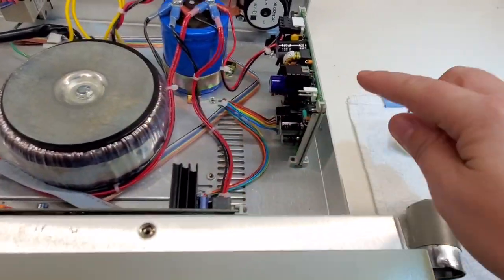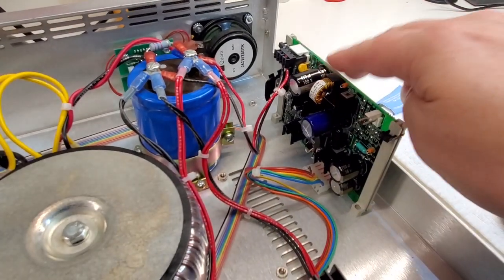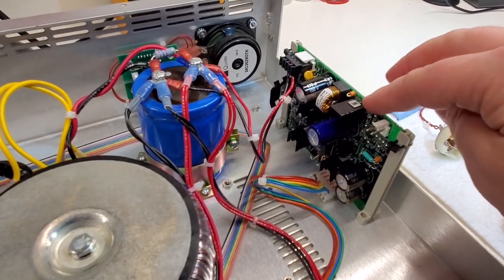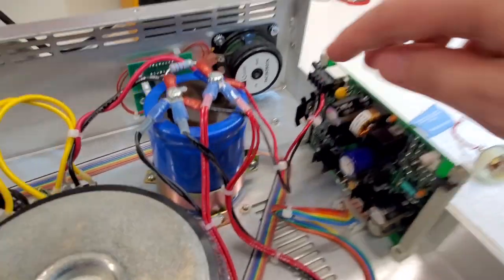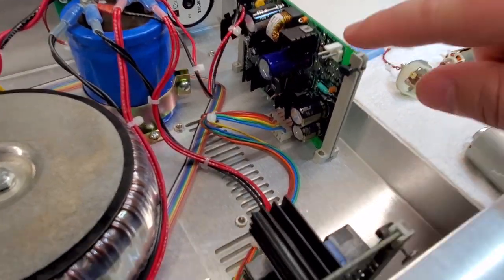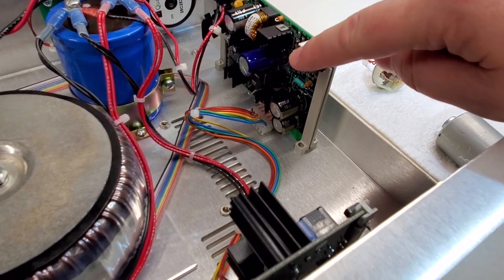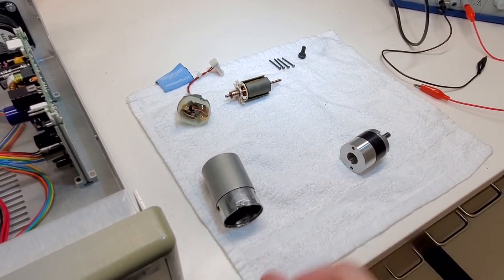And the other piece comes on over here, and they call this guy a power board, which I guess it does, but it's also a motor driver board. You can see it's got voltage regulators, but at the same time, it's got drivers. And this is where my irrigator motor plugs in. And you can see it's only got two wires, so that makes it a brushed DC motor.